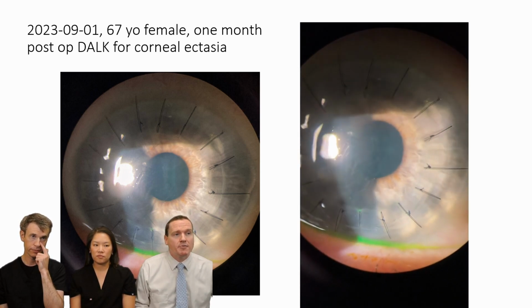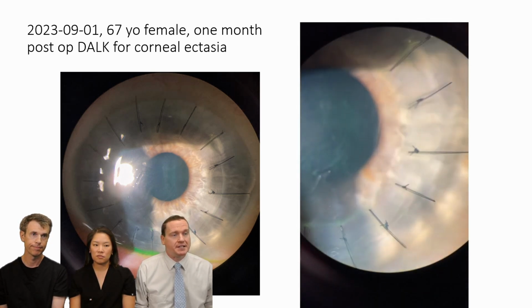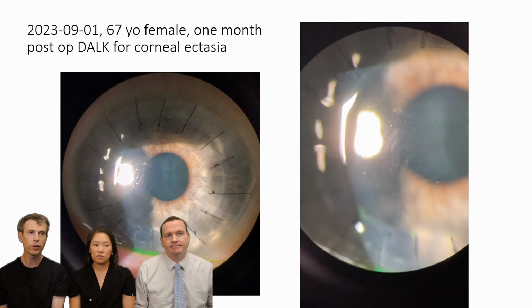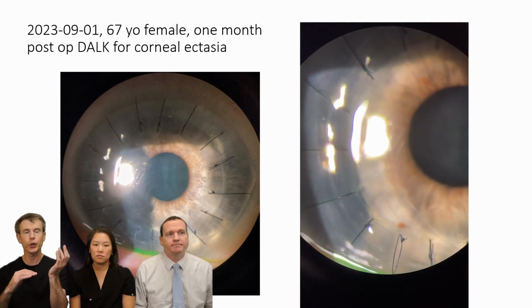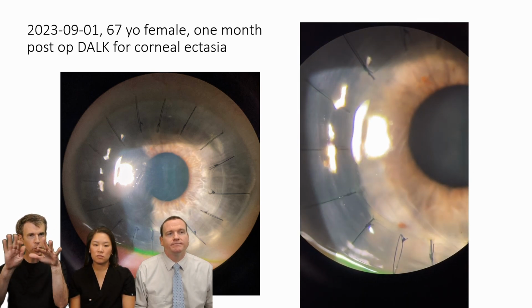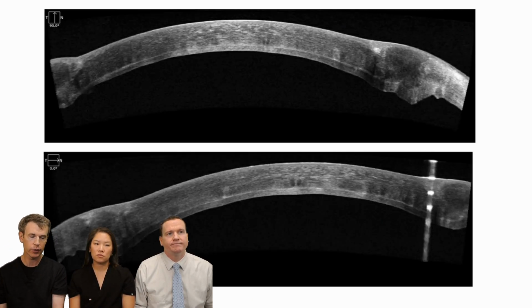This is a 1 month post-op, a patient with corneal ectasia, and this is with the appearance post-DALK in this particular patient. You will see usually Descemet's folds. They're not from swelling, which they're most commonly, but just because the new tissue has a different curvature than the patient's tissue. So there'll always be some irregularities that we try and avoid as much as possible. But again, over time, they should flatten out more and more and get tighter and tighter.